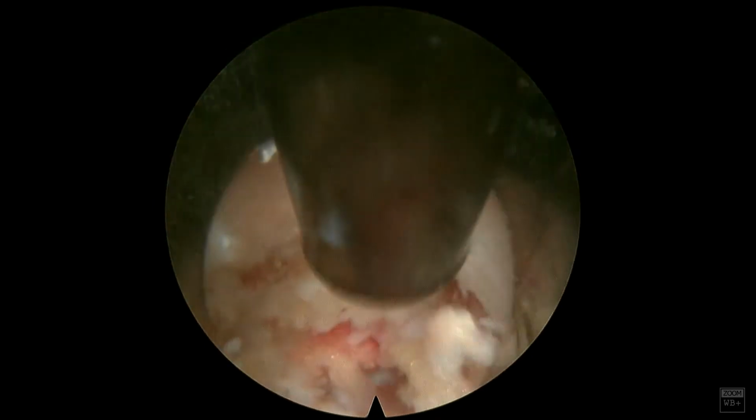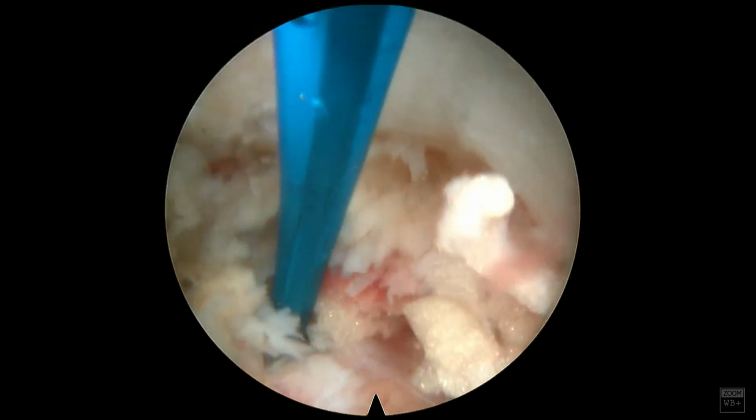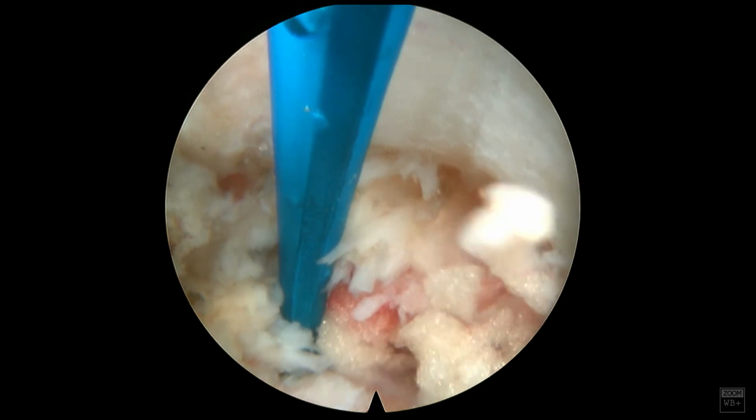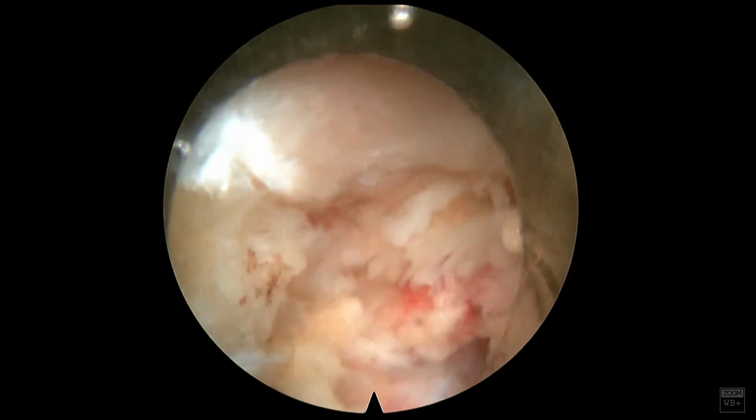You can use the bipolar setting rather than the vape setting and touch it to any of the structures to see if you get any EMG activity. I do monitor all these cases with EMG, and so that's always good to do.